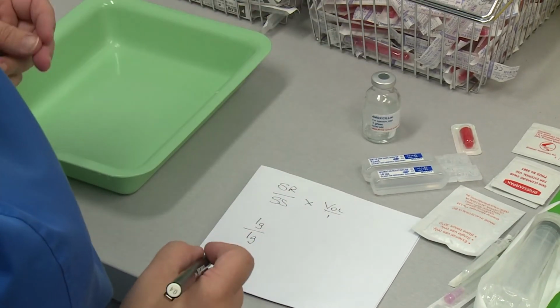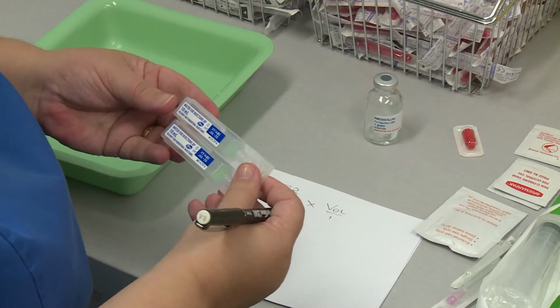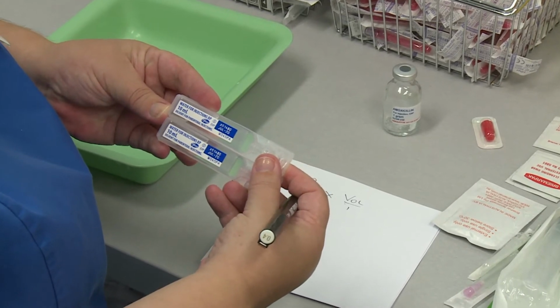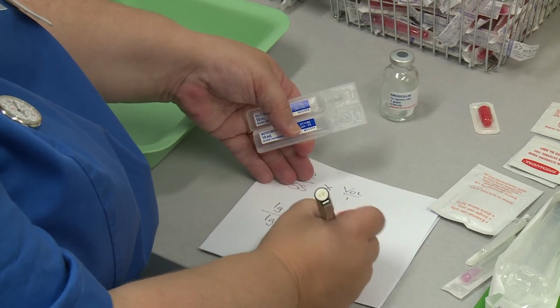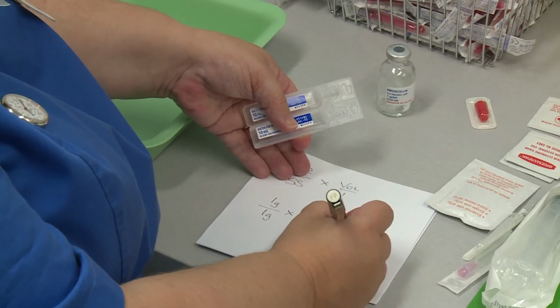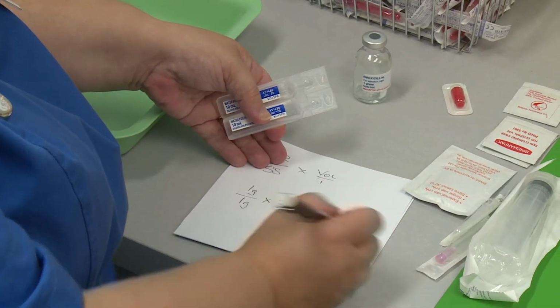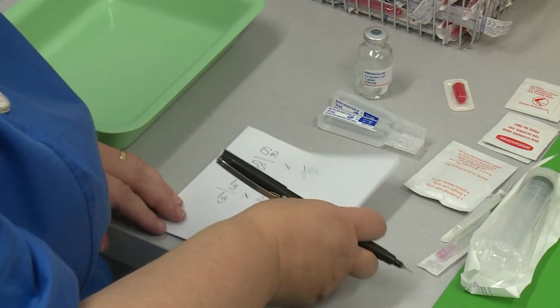And the volume I'm going to get from the Australian Injectable Handbook, because it told me I'm going to be using 20 ml of water for injection. So my volume is 20 over 1. So that means I'm going to be drawing up 20 ml. That'll be 20 ml I'll be giving to my patient.